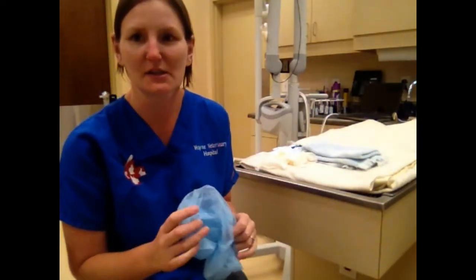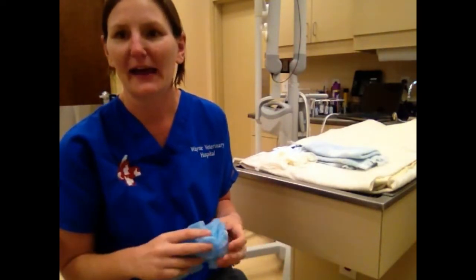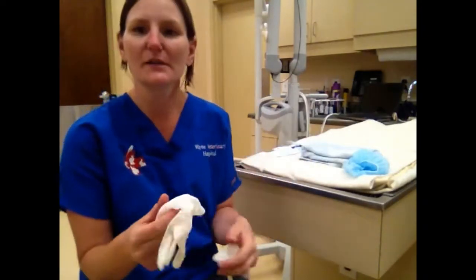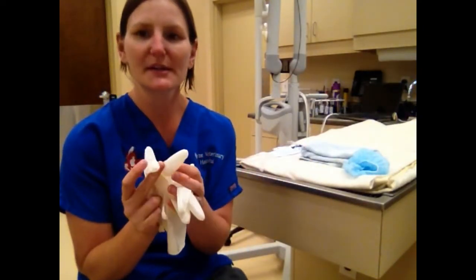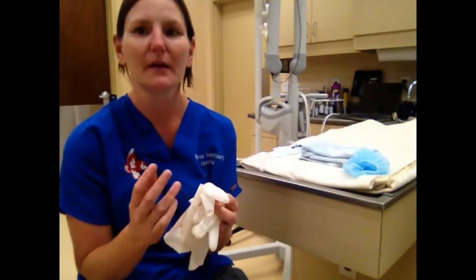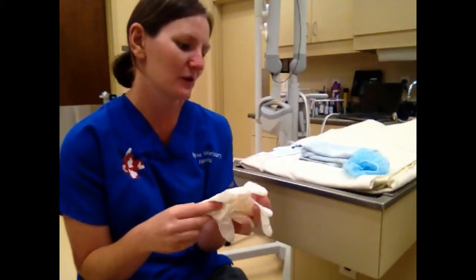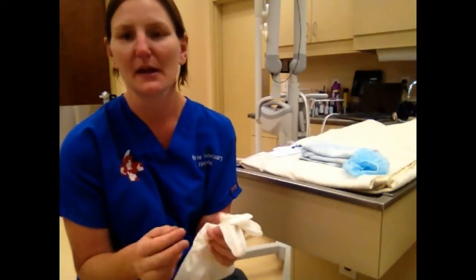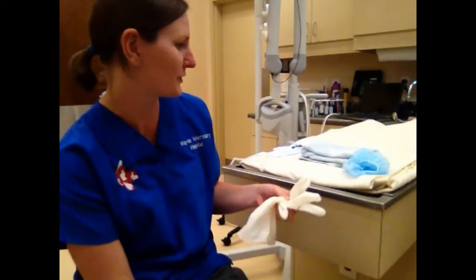And then for personal safety, for me performing the dental, I do have a surgical cap. This is purely personal, just to keep any debris out of my hair and prevent my hair from falling over my eyes while I'm performing the dental. So it just keeps everything nice and clean and out of the way. Obviously, non-sterile gloves, and we use these to prevent the absorption of bacteria in the mouth into the skin, and also to prevent any toxicity that may be caused from any chemicals that we may be using today in the process of doing the dental.